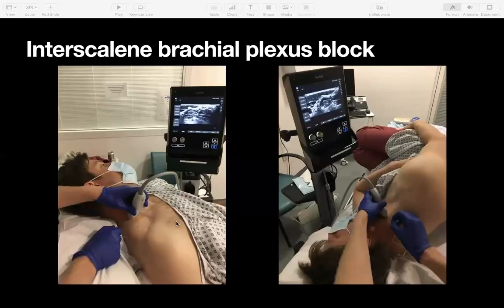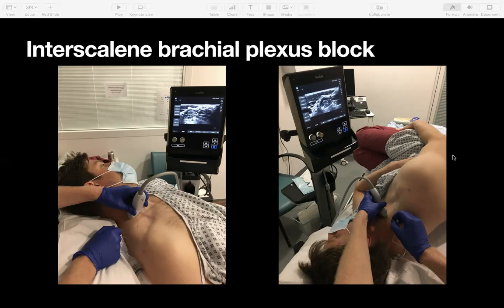A couple of pictures here show the different setups. The supine setup has the patient's head turned to the other side, though sometimes there isn't enough space to fit the needle and your hand with the pillow or bed in the way. Sometimes it's easier to turn the patient lateral, which opens up the space ergonomically, can be easier to work in, and can give you a slightly better picture on the screen as well.